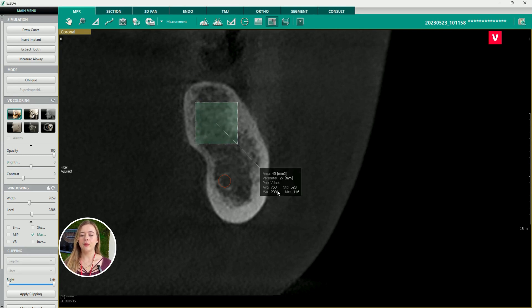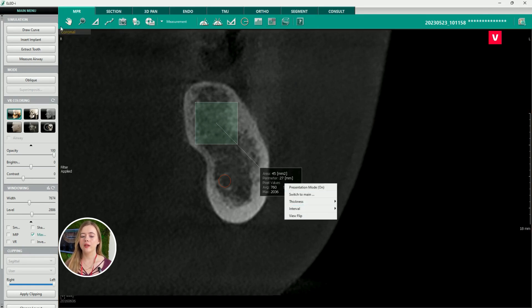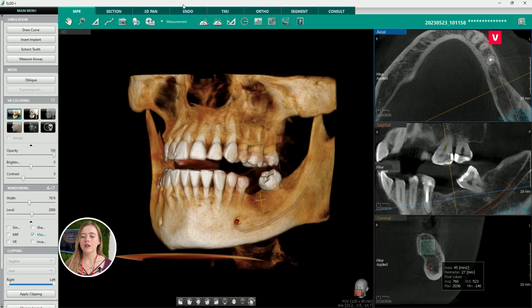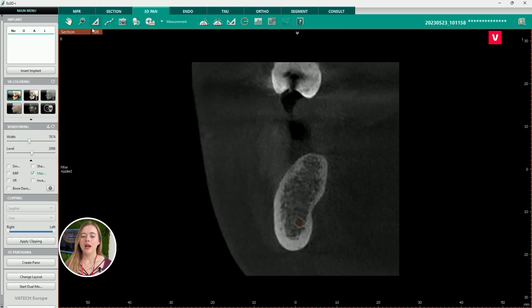The last step in implant planning is the measurement of distance between the alveolar ridge and the mandibular canal, which will easily determine the length and shape of the implant. As you can see in this case, the distance is 15 millimeters.